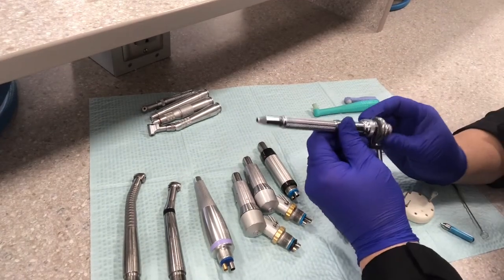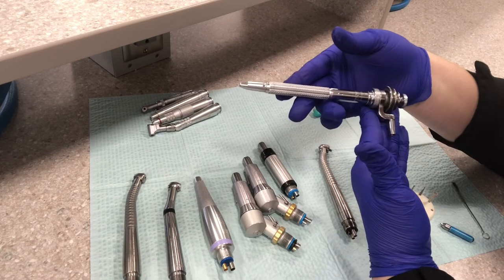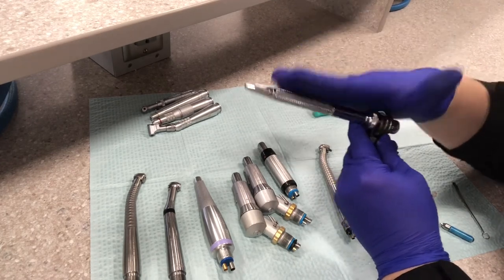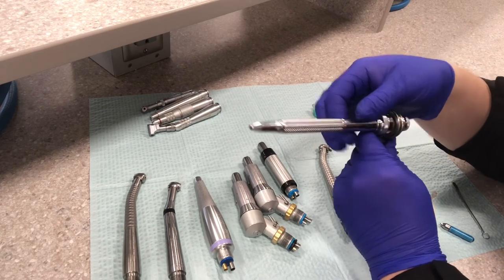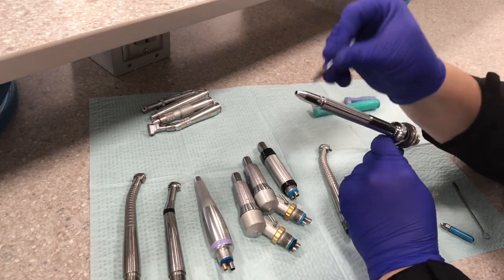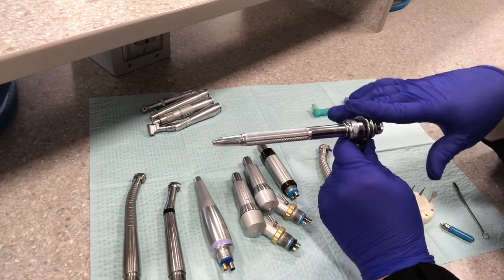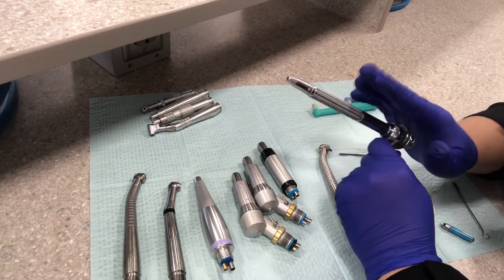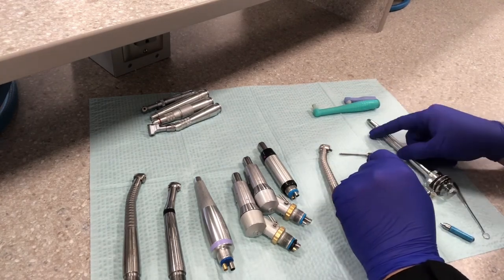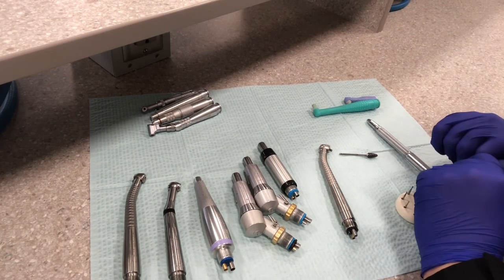And this one is on here just to show you — this is the straight handpiece that you've already used with the lab engine. It's only used with the acrylic burr or the handpiece burr, and it's only used on the lab engine or the belt-driven handpiece. We never use this in a patient's mouth. And that is all the handpieces.